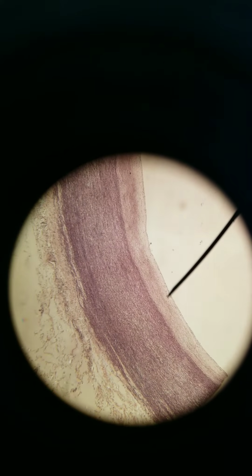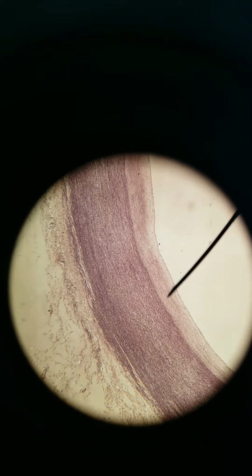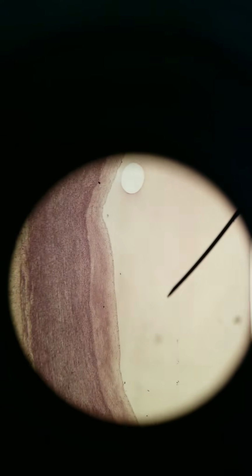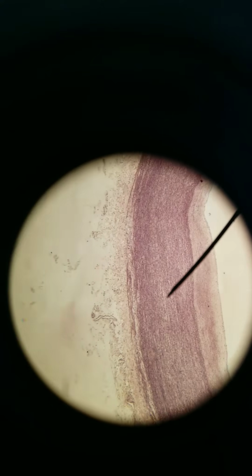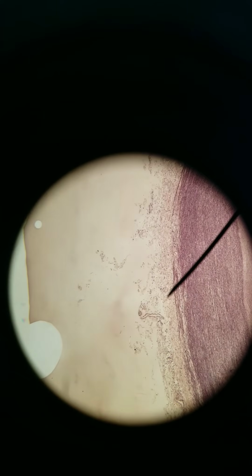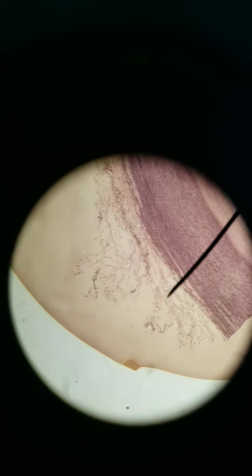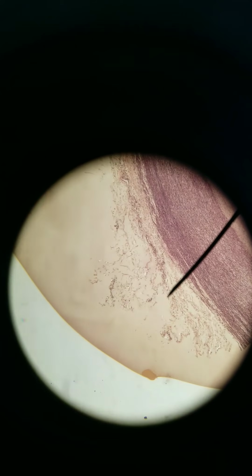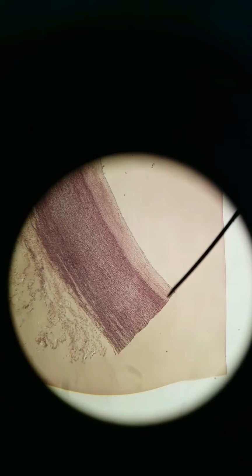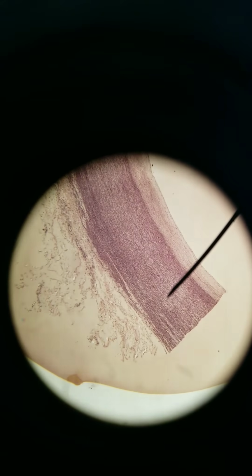Let's start with how we can tell which side is towards the lumen, where blood flows through, versus what's the outside towards the outer connective tissues and linked up with other things. The curvature does help. So where the arrow is right now, this is the lumen. But what can also tip you off is out here, this layer is more irregular. It's dense irregular. So this is the outer layer, tunica externa or adventitia. This lighter part is the inner layer, tunica intima, and then the dark part in the middle, that's tunica media.